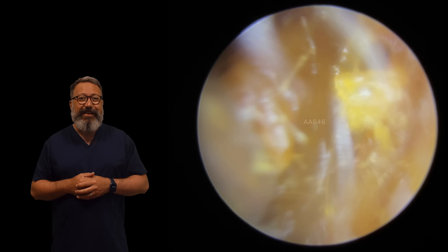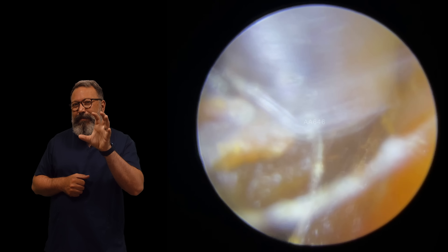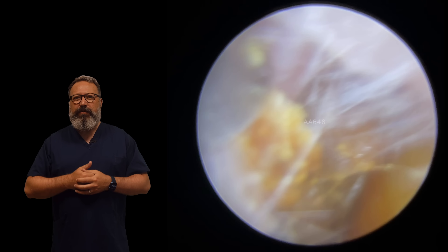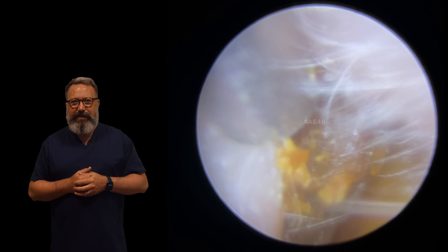There you can see it really does not want to budge, but we're just starting to get that little bit of movement. It's just starting to come out of the canal. We've had to drop the endoscope now a bit further back to accommodate this coming out of the ear, which is why you can see the little cilia. Is it going to get stuck? Is it going to come out in one piece?